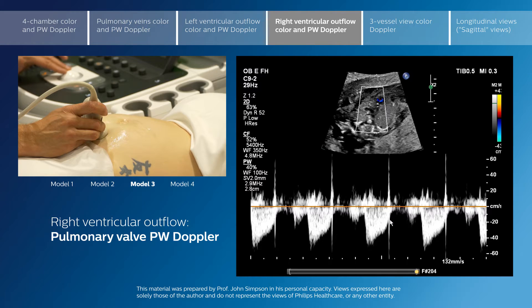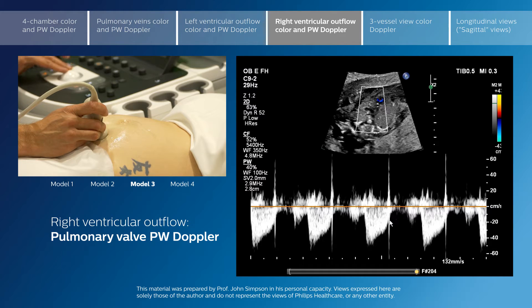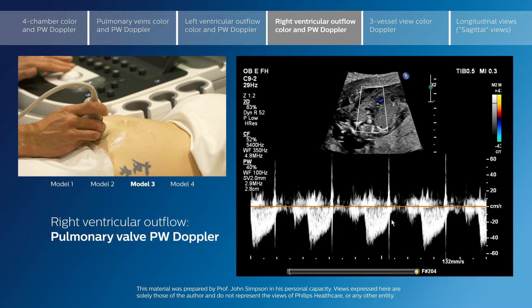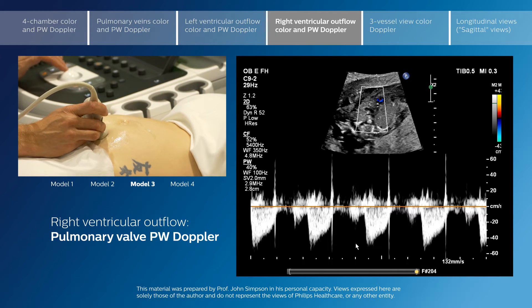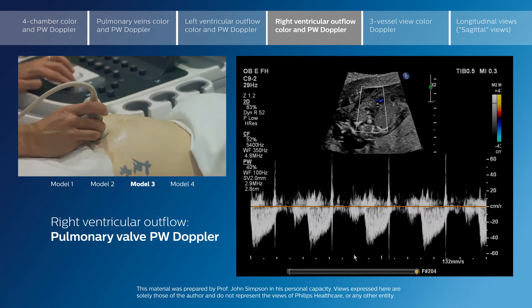As we see here, you can see the closure click of the pulmonary valve, which indicates that you are at the level of the pulmonary valve. The Doppler velocity in this case is around 50 centimeters per second, which is perfectly normal.